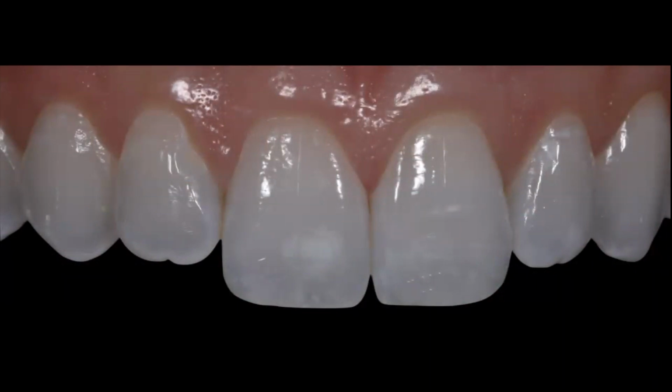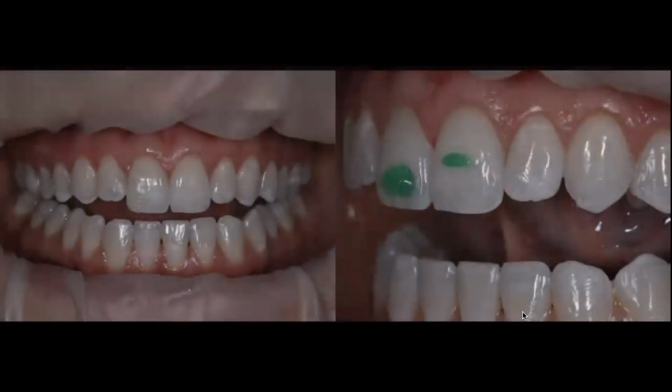This most likely may have been some white spot left after orthodontic treatment. And again, these are common white spots seen on patients after orthodontic treatment. They were small, they were not that opaque. In my mind, these are lesions that can be treated without any reservations with resin infiltration. And here is where I'm going to use that technique.